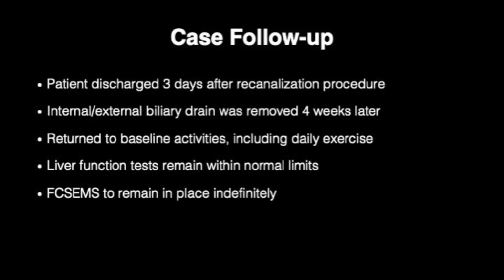Our patient was discharged 3 days after his recanalization procedure. The internal-external biliary drain was removed 4 weeks later. At present, he is back to all baseline activities, including daily exercise. His liver chemistries remain within normal limits, with no concern for biliary obstruction or cholangitis. He will be managed expectantly with no plans for removal of his fully covered metal biliary stent due to his age, medical comorbidities, and the uncertain risk of bile duct stricturing following stent removal.